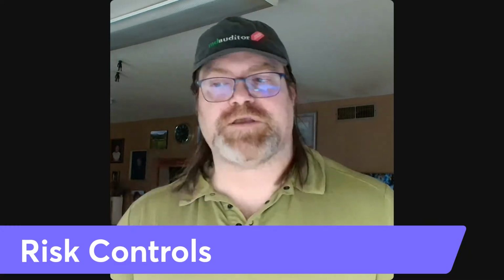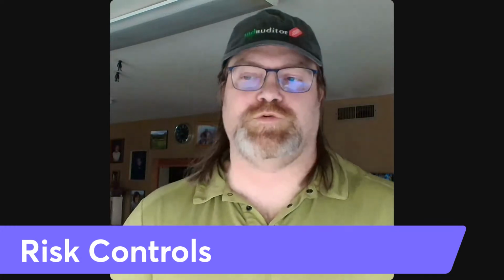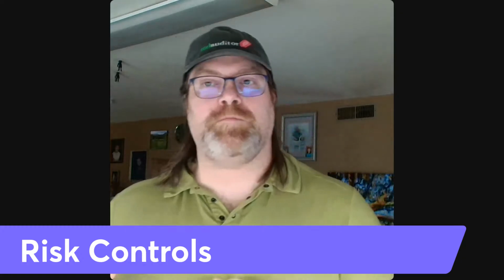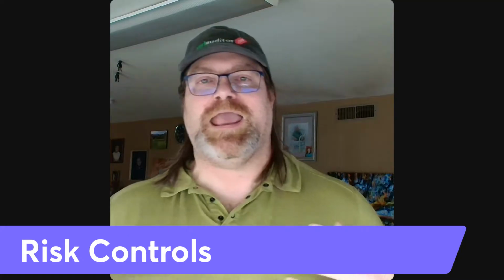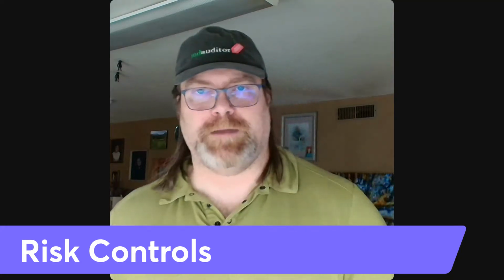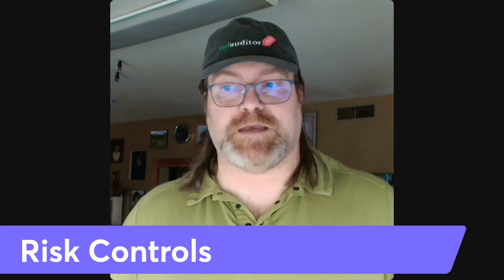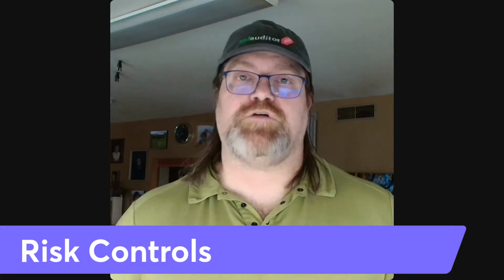If you have specific milestones that are critical, find out what those are, particularly if you're integrating your software with somebody else's. And then if you have certain things that are going to be critical milestones with a lead time, something that can't be done in more the agile method and has to be done more like the waterfall method, like a pre-sub, you have to build in those buffer times. So the FDA requires 75 days for scheduling these pre-subs. Build that into your schedule. So you're not going to be able to do 100% agile. You have a 75-day cycle for every pre-sub.